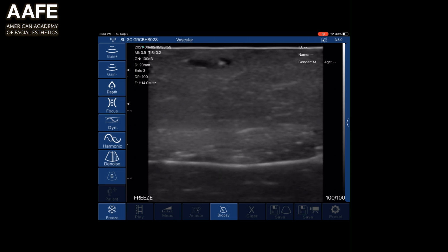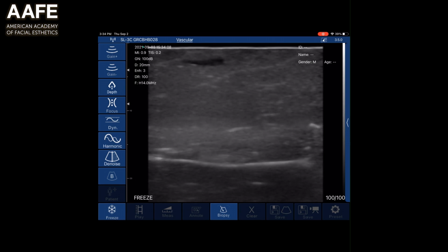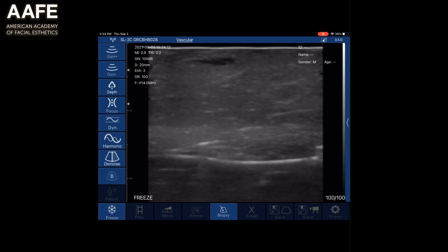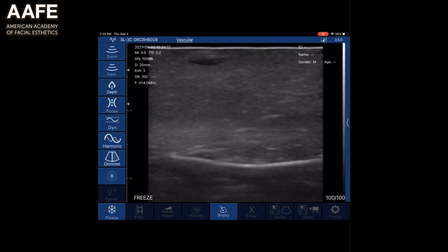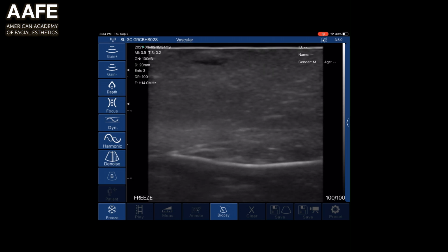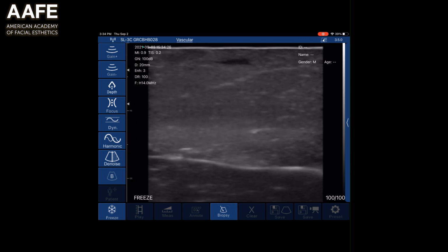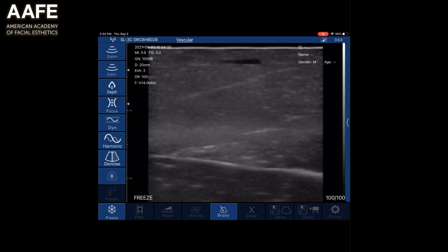There's the filler. That's exactly what freshly placed filler looks like in an ultrasound here. And then if I would put a Doppler on in the B mode, that's what it looks like. If I put the Doppler on, there would be no red or blue because there would be nothing traveling in it. Now, what's amazing about this, let's say this was causing a vascular compression or a vascular occlusion or some kind of vascular event, what we can go ahead and do is we can use the ultrasound unit to go ahead and actually measure how big this is here.